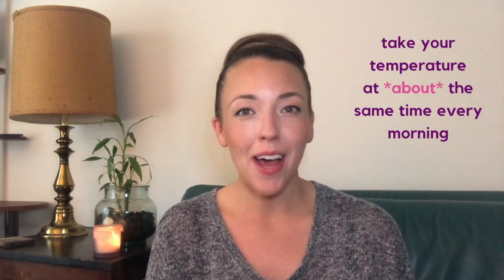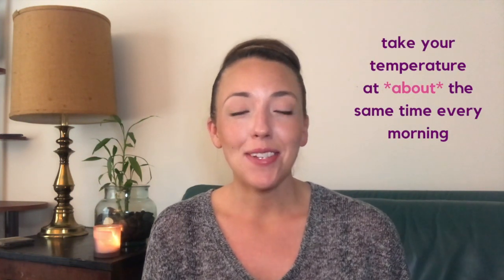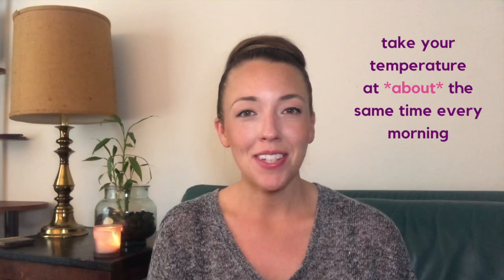Okay, moving on to number 4. Take your temperature at about the same time every morning. Now, some women get a little bit caught up on this one, so I just want to go ahead and clarify. It does not have to be exactly, to the minute, the same exact time every day. Anything within about an hour range of when you normally take your temperature is completely acceptable. So if you normally wake up at 7 and one morning you wake up at 6:30 or at 7:30, that's okay.